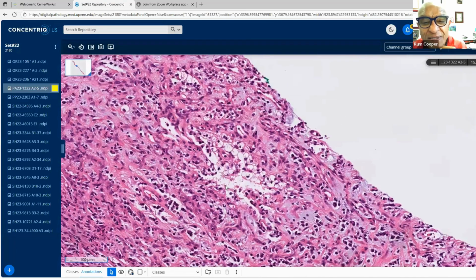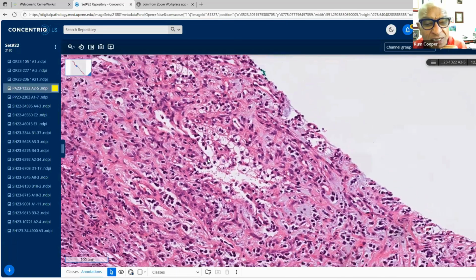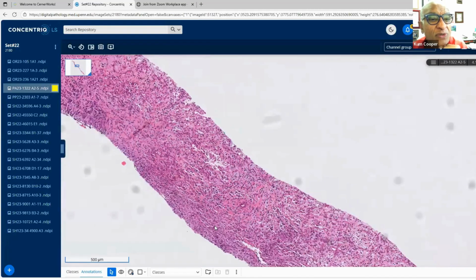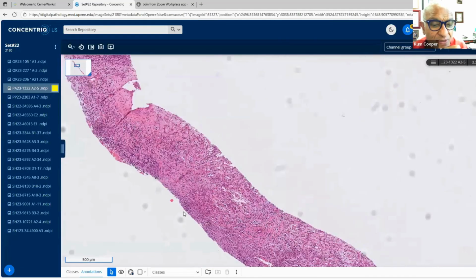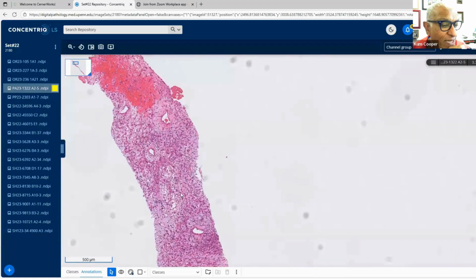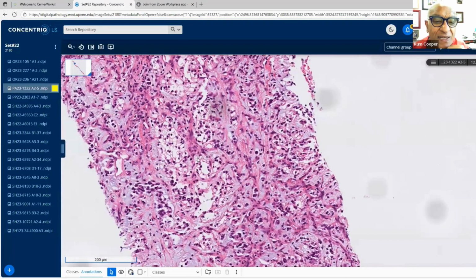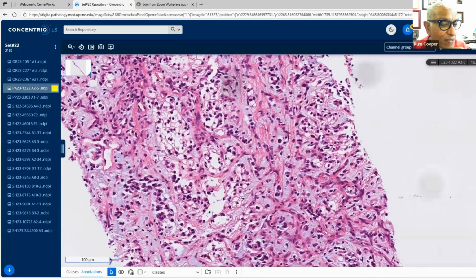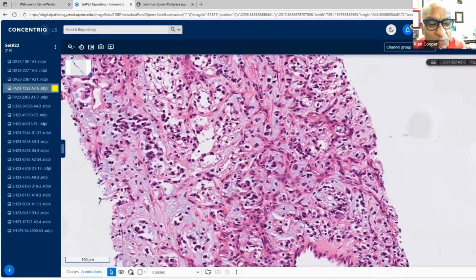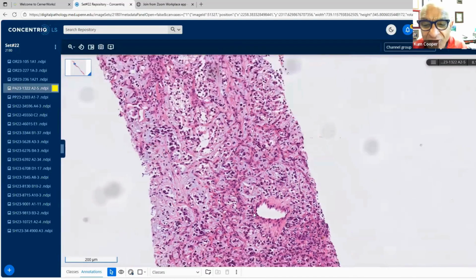It's a good thought. But I want to draw your attention to these islands here. Now look at these areas in contrast to the surrounding areas. And then I just want to show you a few more of those areas. Myxoid AML, angiomyolipoma. How about this area here? Yeah, those are the dedifferentiated liposarcoma I would consider in the perinephric ones. This is more in the sinus, renal sinus fat.